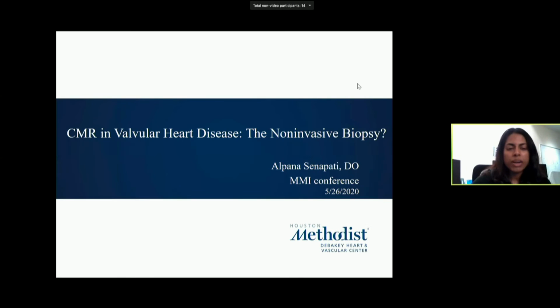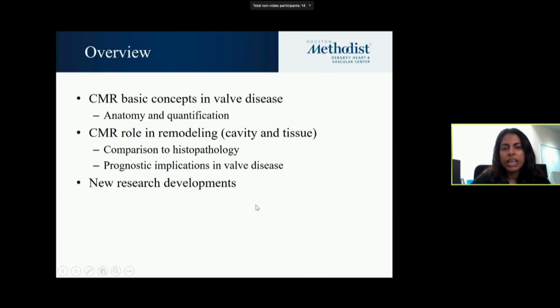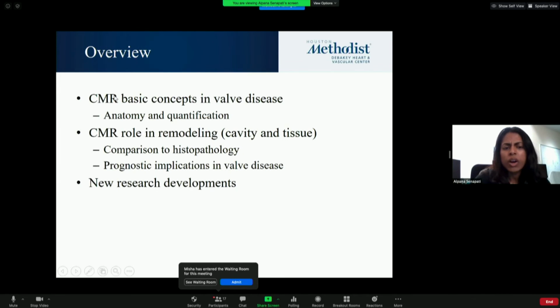So today I'm going to talk about cardiac MRI and valvular heart disease, and is this really the non-invasive new biopsy? And so overview, I'm going to talk about the CMR basic concepts in valve disease, anatomy and quantification, CMR role in remodeling, cavity and tissue remodeling, comparison to histopathology, and the prognostic implications in valve disease. I'm going to highlight some of the new latest research that's in this field, and also talk about some of our new research developments that we have going on.